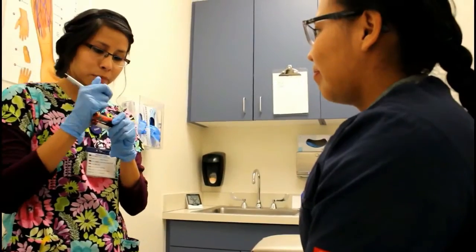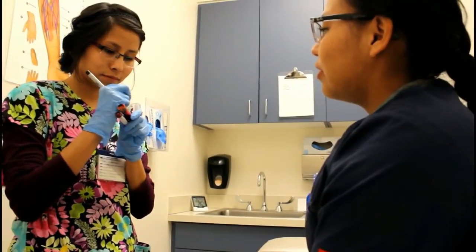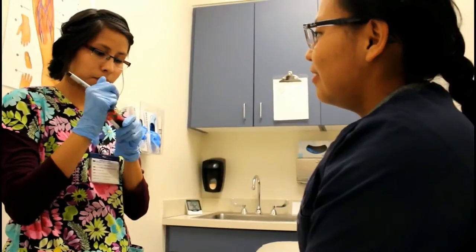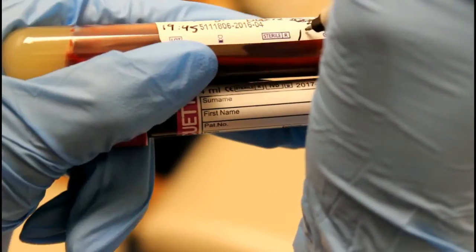Make sure you label all the tubes. Again, ask the patient to spell their last and first name and date of birth on site. Other information includes today's date, time of draw, and initials of phlebotomist.